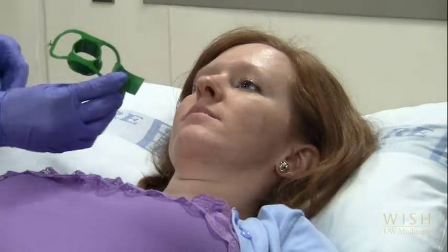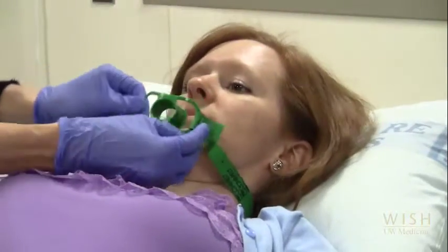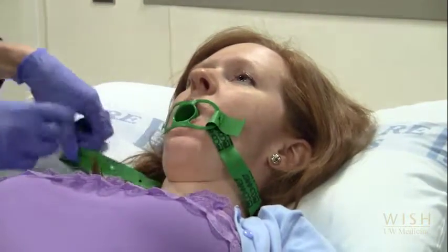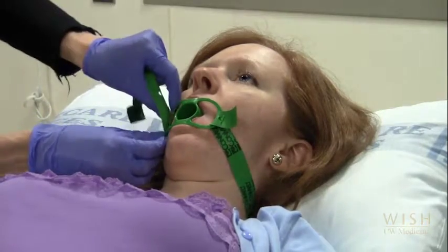The flexible bronchoscope may be inserted through either the mouth or the nose. If inserting through the mouth, a bite block must be used to prevent the patient from biting the bronchoscope. This will cause thousands of dollars in damage if the fibre optics are damaged.